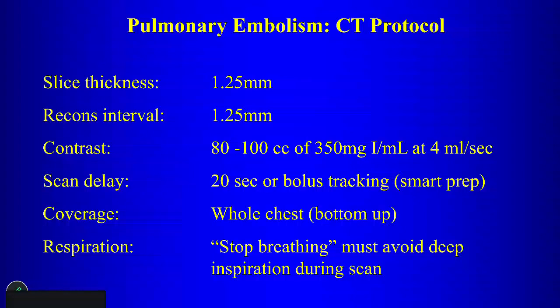But why is that? Why, when you look at a PE scan, does it go from the bottom up, as opposed to top down? That PEs are more prevalent at the bottom? Okay, but so what? Why go from the bottom up? Older scanners maybe slower or something? What are you getting at? Maybe the contrast, best captured at the bases? Like your best images are going to be at the bases? Why? Because of the contrast timing? No, it's not. Motion? Is it respiratory motion? Yeah.